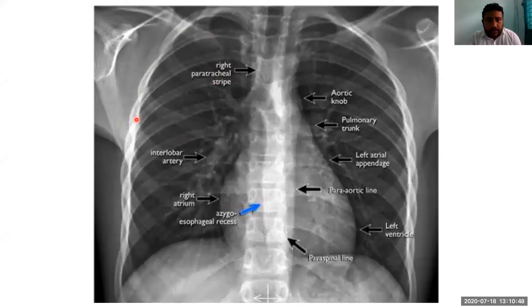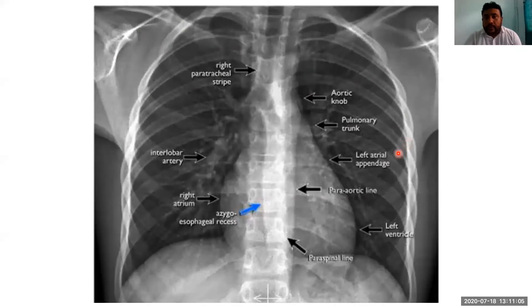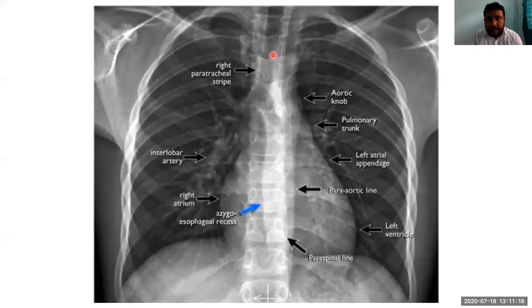These are the ribs — we look for any fracture or deformity. Likewise, on the opposite side, we see the ribs one by one. Next, we come to the mediastinum. In the mediastinum, the tracheal rings do not appear on the X-ray, but the column of air — which is hyperlucent, blackish in color — you can see; this is the trachea.